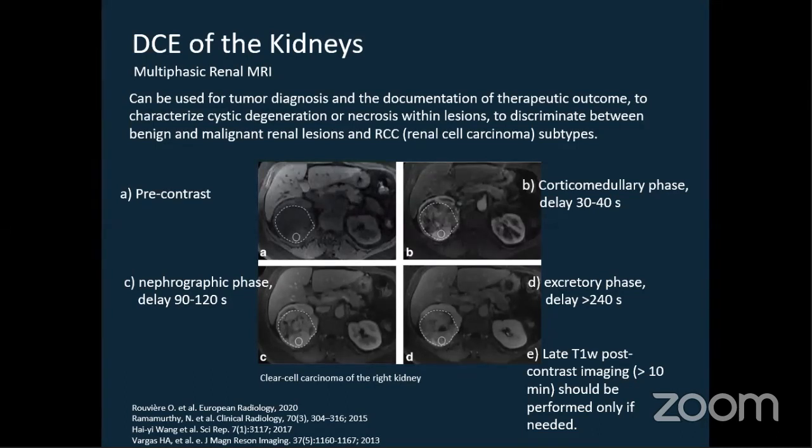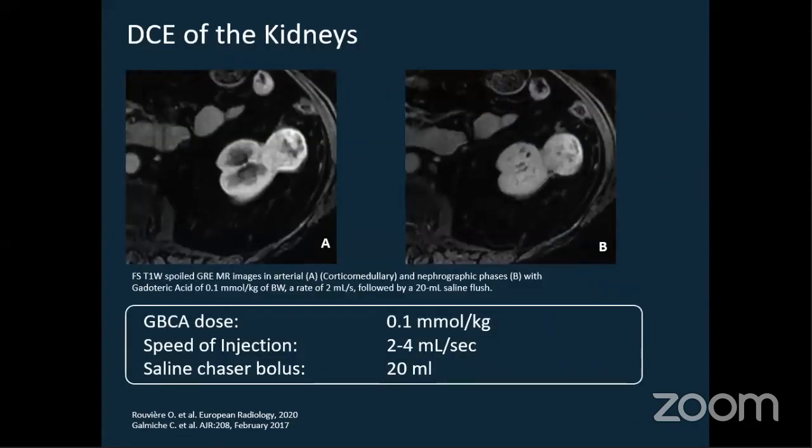In 2020, the French Society of Genitourinary Imaging published a document aimed at achieving consensus on patient preparation and imaging protocol for renal multiparametric MRI in adults. In this document, multiphase contrast-enhanced imaging was also considered a mandatory part of renal MRI. They agreed that unless contraindicated, an intravenous injection of contrast medium should be systematically performed, and the contrast medium should be injected at a rate of 3 or 4 milliliters per second, although in studies we may see good results also with a lower speed of injection, like 2 milliliters per second, taking into account again that the temporal resolution in this case is not high.